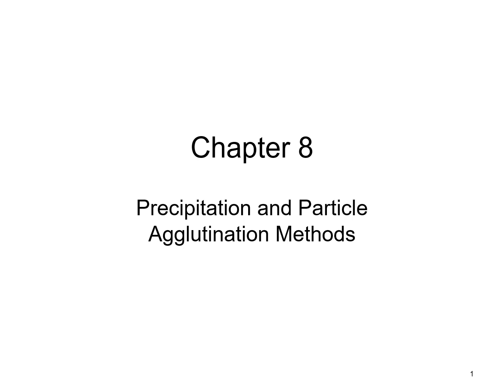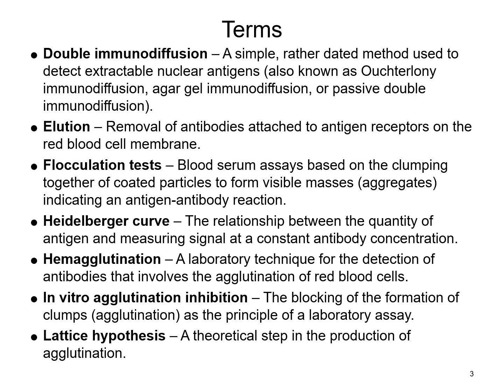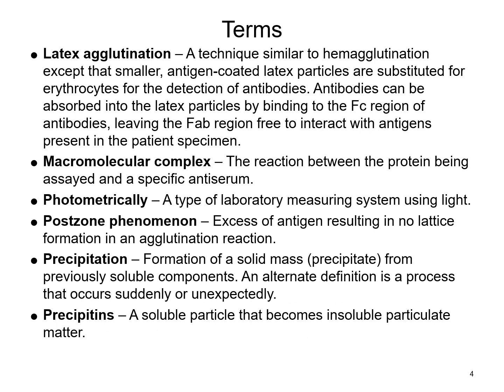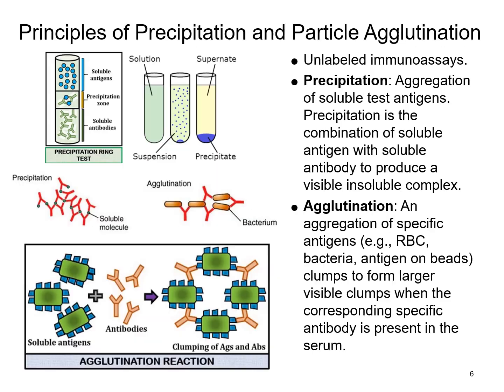So this lecture will cover Chapter 8, Precipitation and Particle Agglutination Methods. Now, these first few slides do list several different terms that you should be familiar with. So just make sure that you review each of these slides and review the terms and the definitions, and just make sure that you understand them as we're going into this lecture.